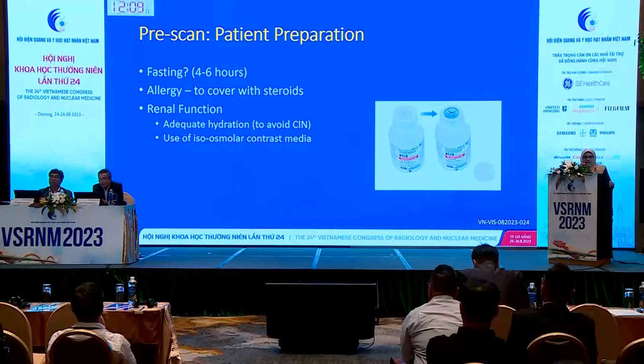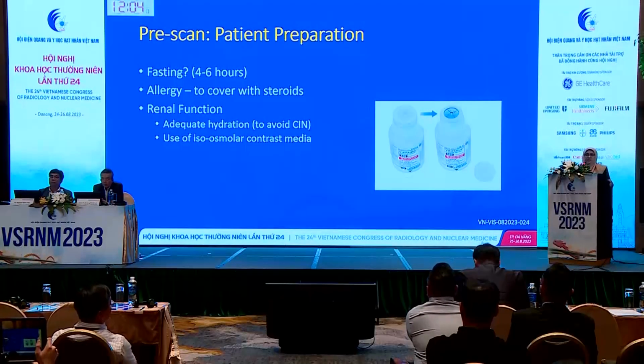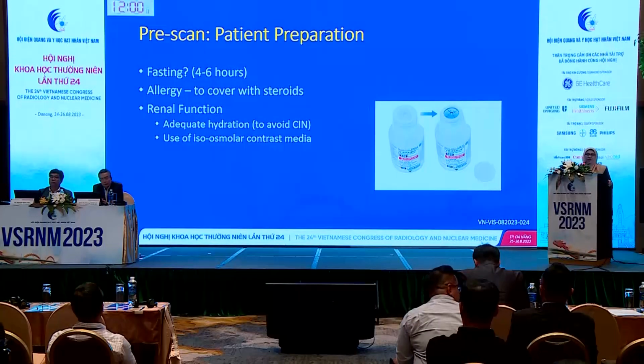So for pre-scan patient preparation, this can differ from center to center. It's up to you and your center which protocol to use. In my center, we still practice fasting at least 4 to 6 hours. The reason is that we are using iodinated contrast. Sometimes we are anticipating if there's any reaction related to that.